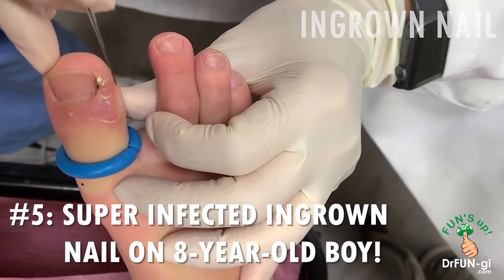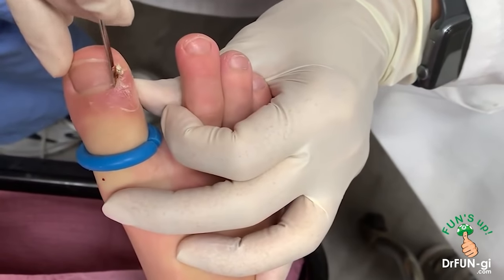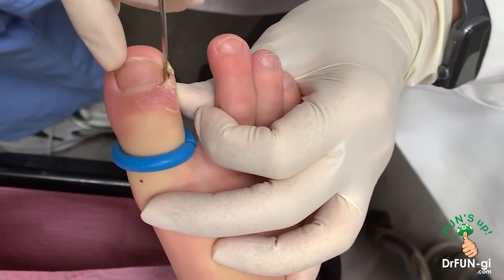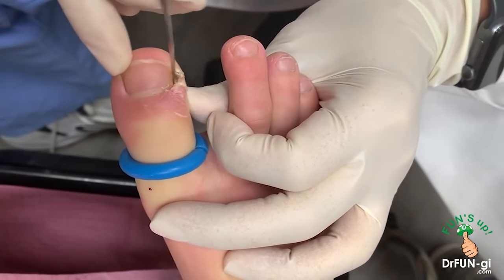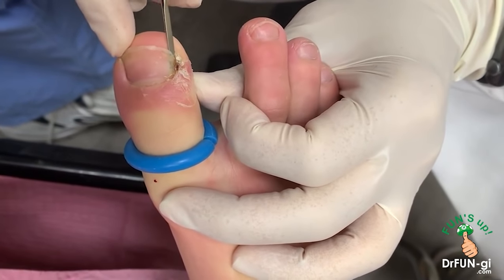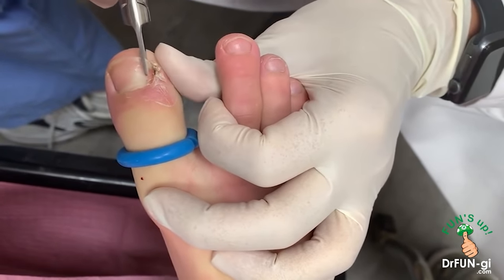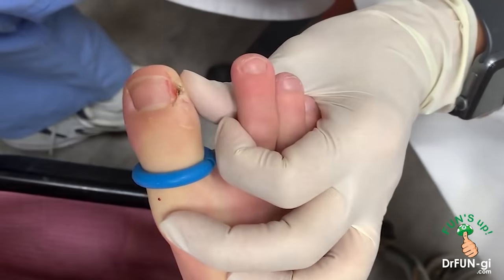It's been infected for about three weeks now, right around this area. I already numbed it and put a little tourniquet on it. Now I'm going in to get it freed up. Do you feel any of this? No. Okay. Let's see how deep it is in there — there's a lot of callus built up around it already. We're going to go in there and free up the top and free up the bottom.